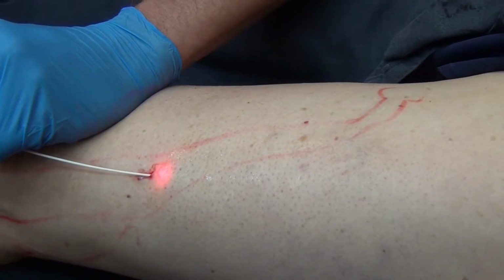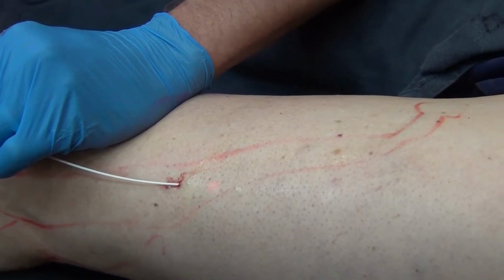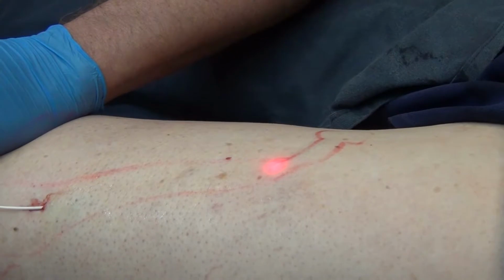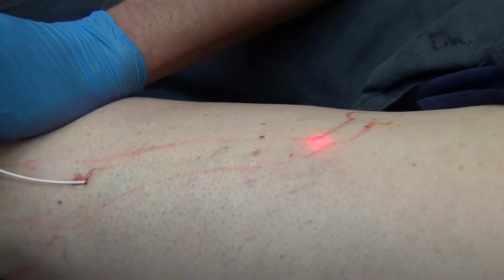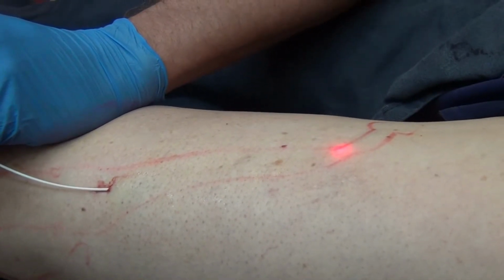A fiber optic has been introduced into the 7 French catheter, and you can clearly see under the skin where it tracks through the length of the abnormal varicose vein. And the advantage, of course, of endovascular lasers, we can see exactly where we are, and we also confirm with the ultrasound that we're not in proximity to any arterial component.